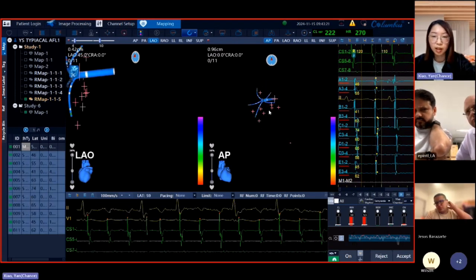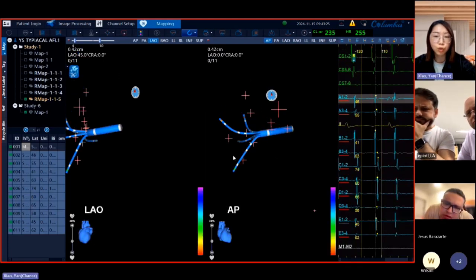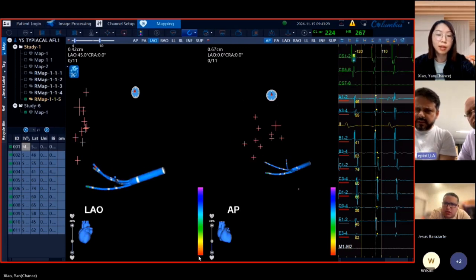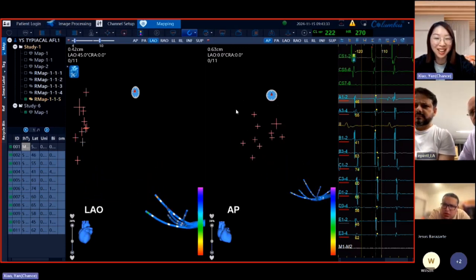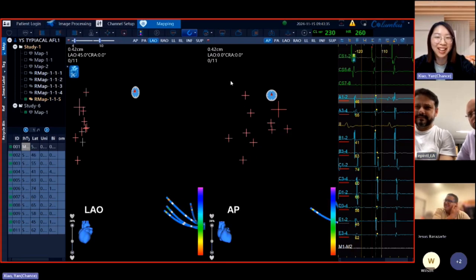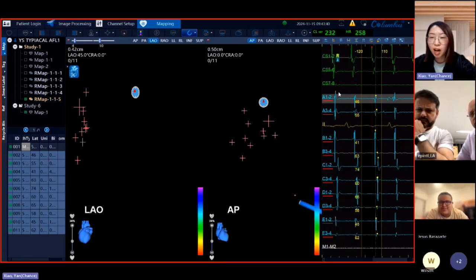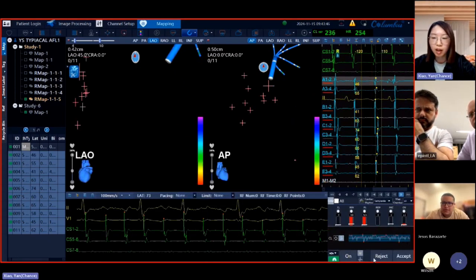I collect, you see, how many points we collected? 1, 2, 3, 4, 5, 6, 7, 8, 9, 10 points. So 10 points, right? Not this one, the speed. We just collected, right? Okay, so you will see how many channels we have here, how many points we collected here.